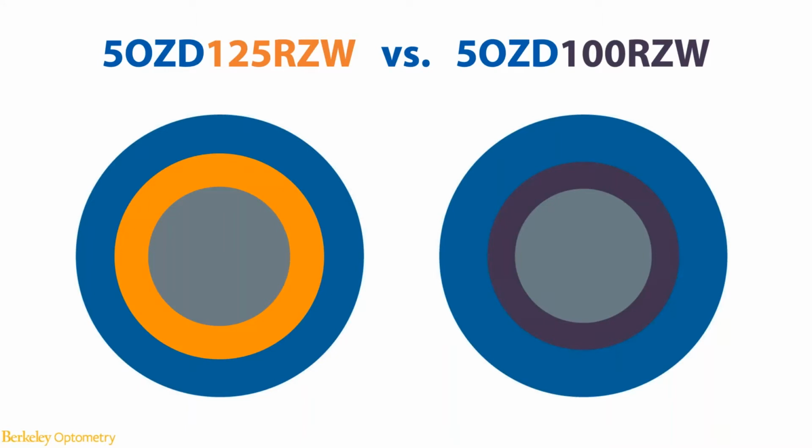So since Ortho-K has become one of the primary options, not only for myopia correction, but also for myopia control, how to design and fit lenses to achieve better efficacy in myopia control has been a very hot topic among researchers, clinicians, and the industry players. One of the most popular theories in the subject area is to design a lens with a smaller OZD based on evidence from several retrospective studies.